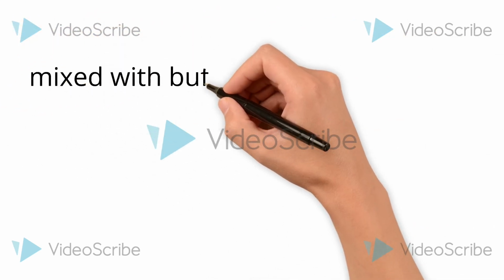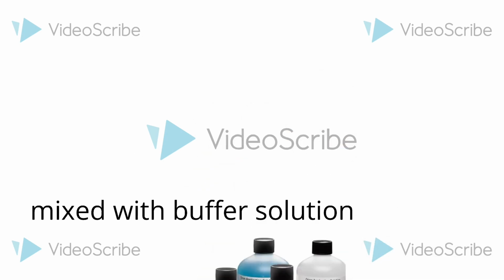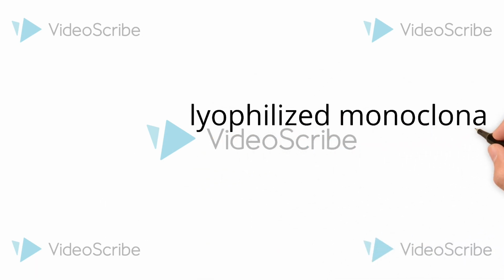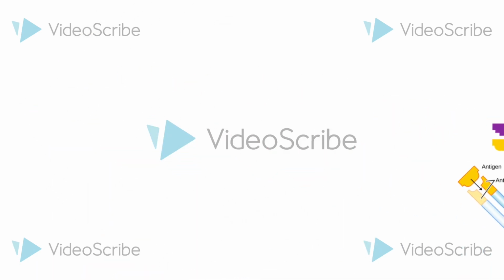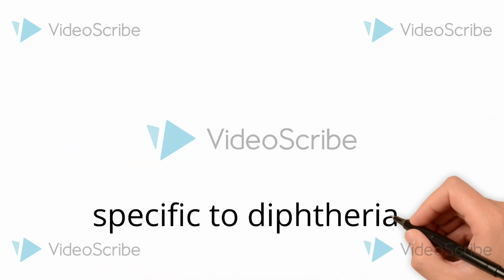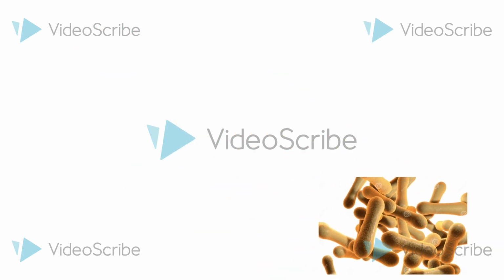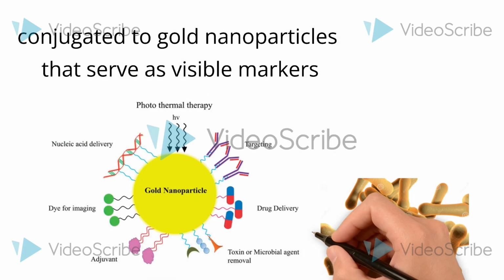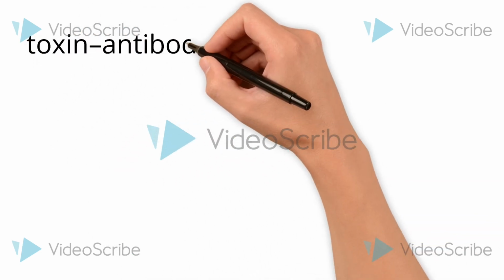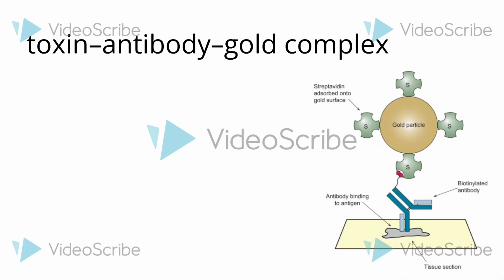Sometimes this sample is first mixed with a buffer solution like Tris-HCl or phosphate buffer to maintain a stable pH. As the sample travels, it dissolves the lyophilized monoclonal antibodies located in the conjugate pad. They are specific to the diphtheria toxin and are conjugated to gold nanoparticles that serve as visible markers. If the toxin is present in the sample, it forms a toxin-antibody gold complex.